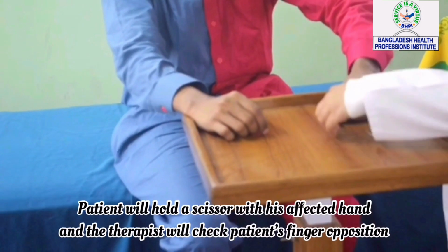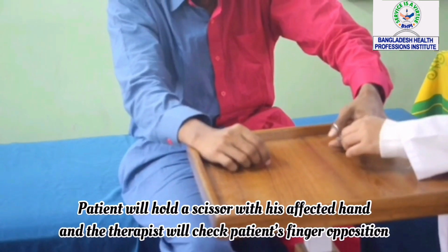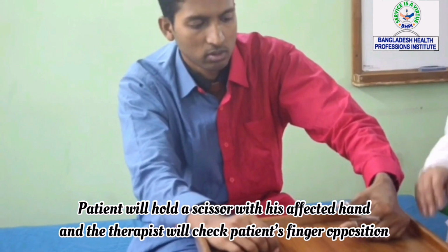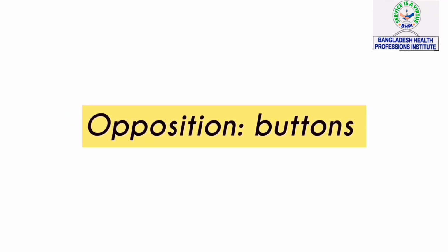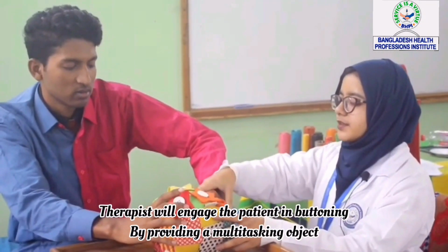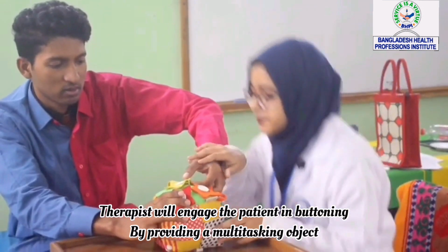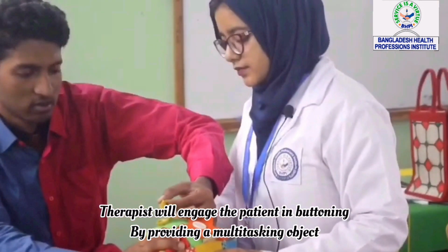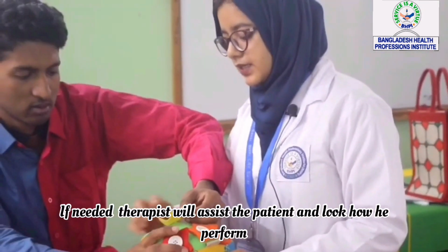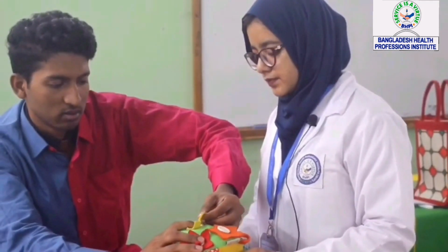The patient will hold a scissor with his affected hand and the therapist will check the patient's finger opposition. The therapist will engage the patient in buttoning by providing a multitasking object. If needed, the therapist will assist the patient and observe how he performs.